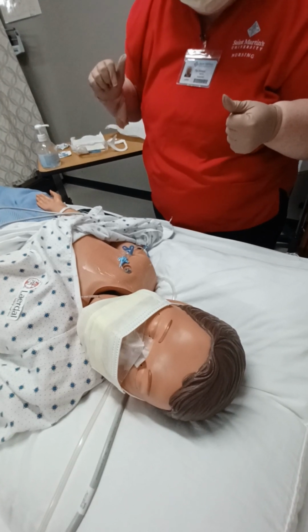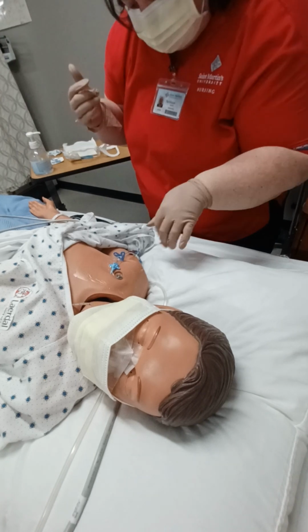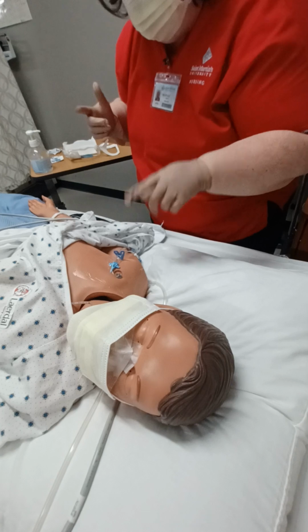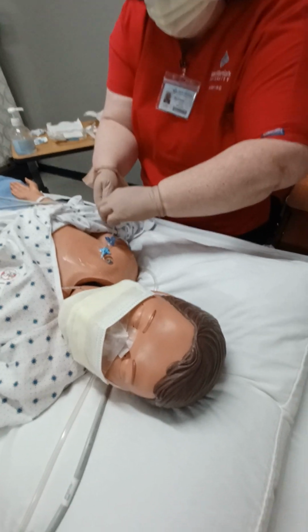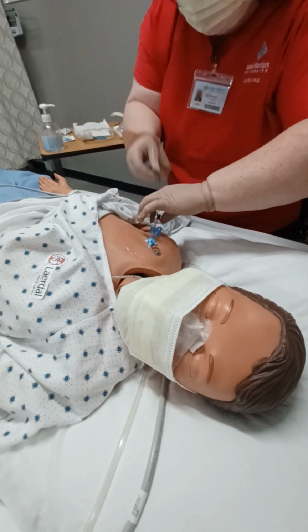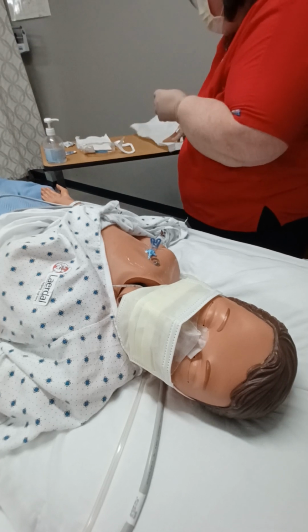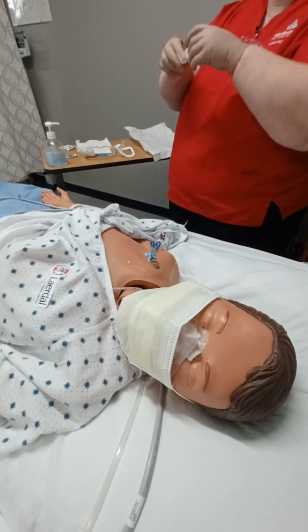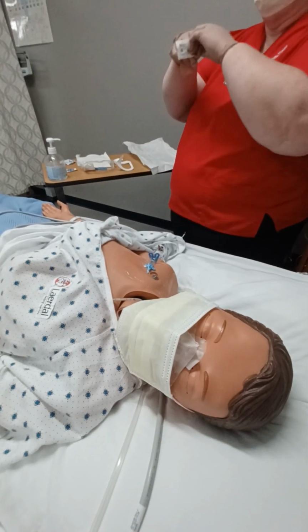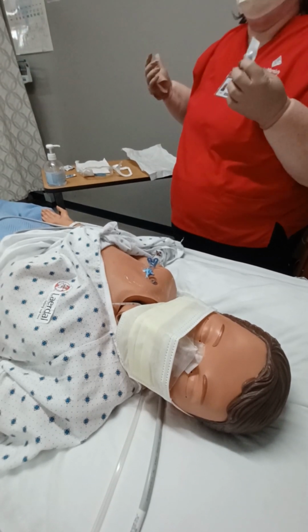Now I am going to change the caps on the ends. So I'm going to make sure both of these are clamped first, one lumen at a time. I'm going to remove the old. There we go. That goes in the garbage. Grab a new one. Can I have my CNA get me 2 sterile flushes, please? I don't have any flushes. It's the only thing I forgot.